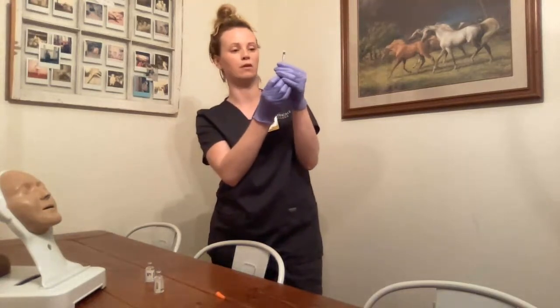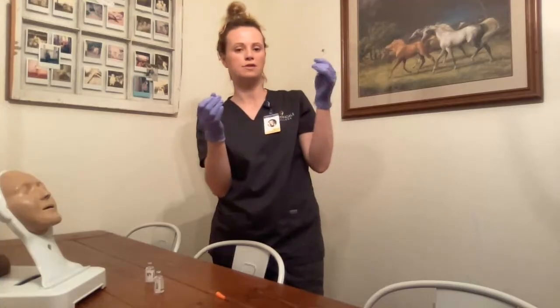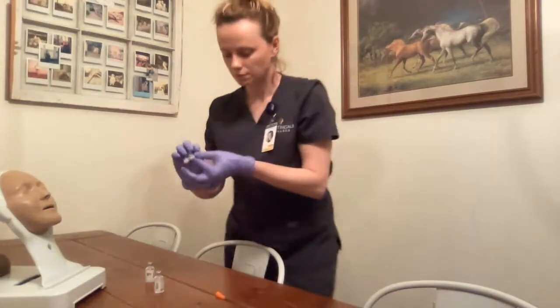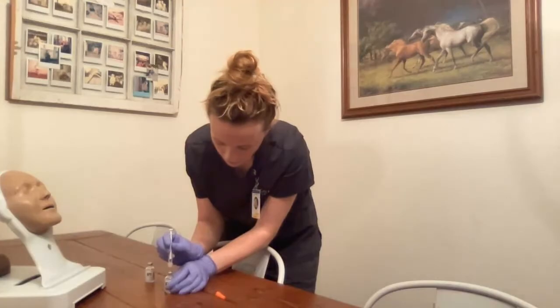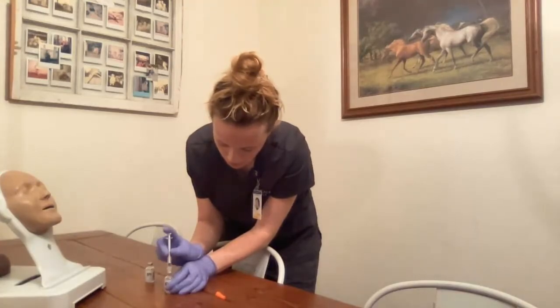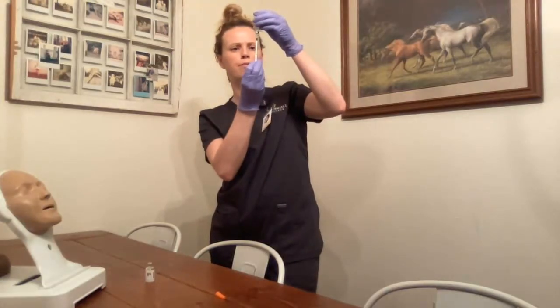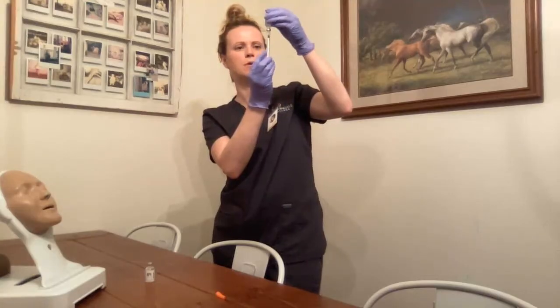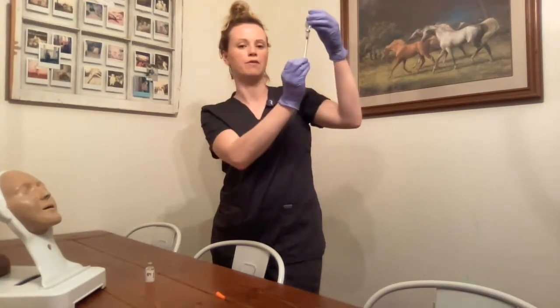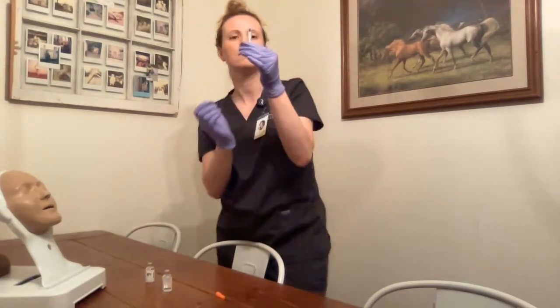Next is the four units of regular insulin. I draw up four units of air — the nurse and I have both verified with the MAR. I inject that air into the regular insulin vial. I then invert and draw up the four units of regular solution. I tap to remove any air bubbles. The nurse and I have both verified against the MAR — four units.